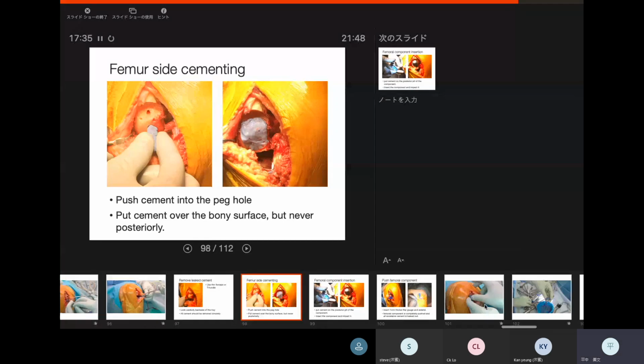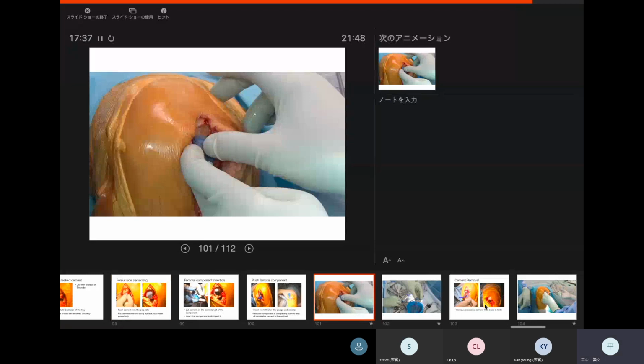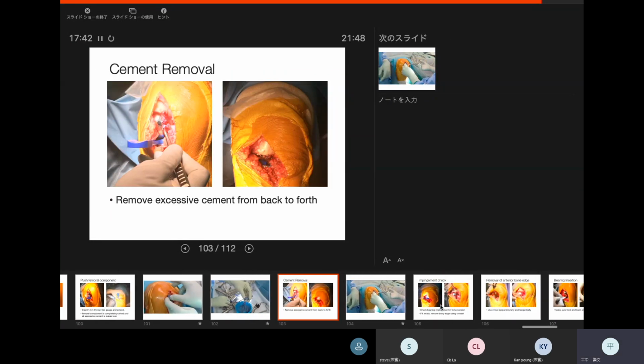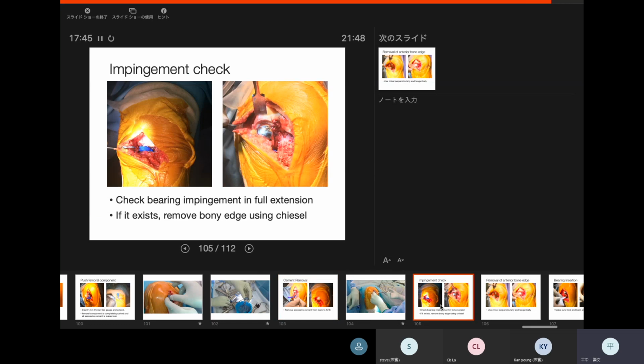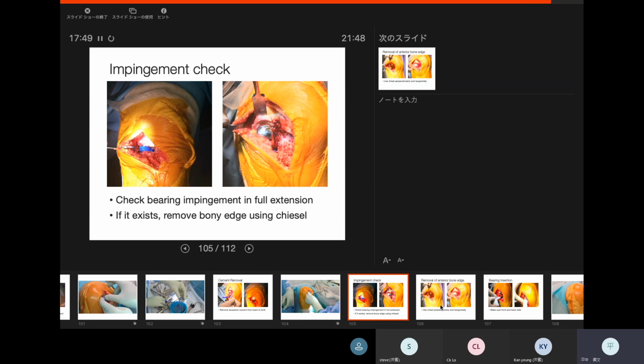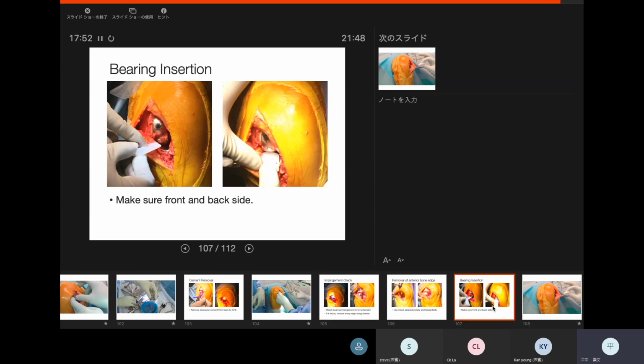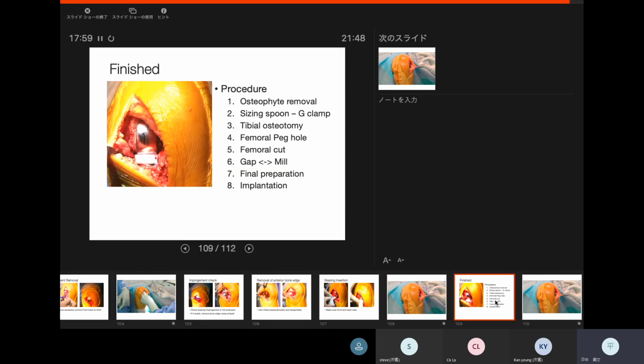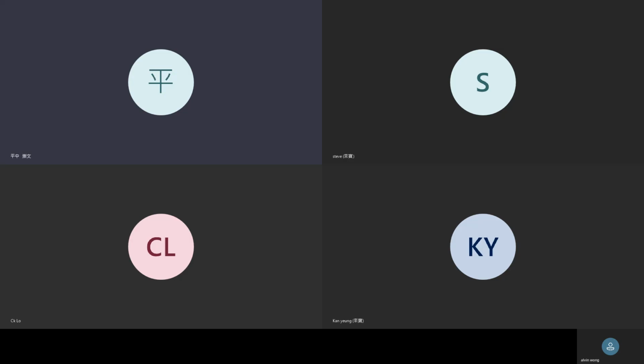And final impaction, and then insert the trial and make sure that the size is perfect, and then insert the real component, the anatomical bearing. This is the end of the operation. Okay, this is the review of the steps of the procedure.